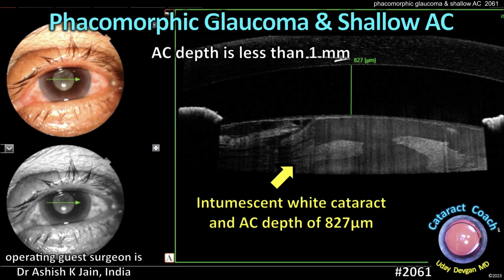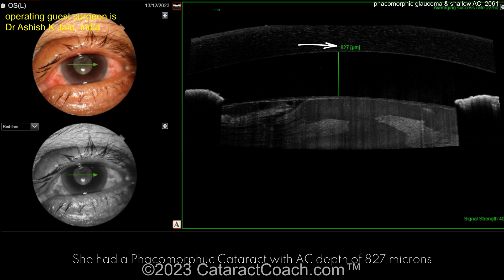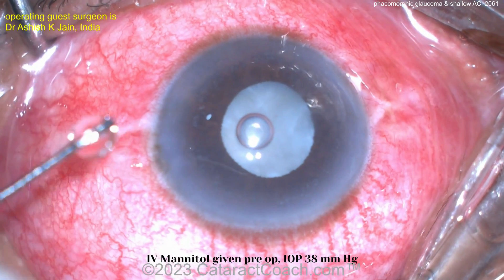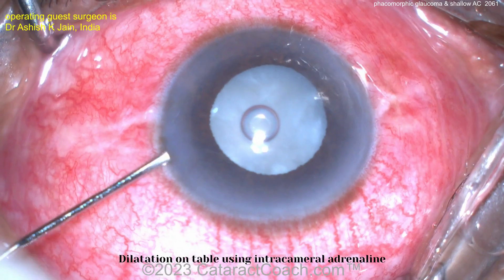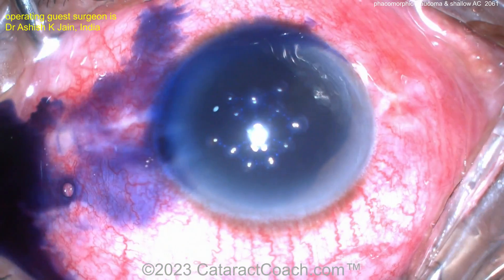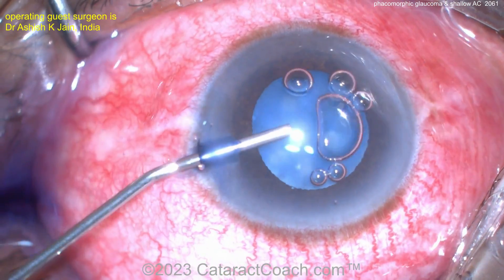Phacomorphic glaucoma and a shallow anterior chamber. The AC depth is less than a millimeter. Tough case — you can see the white cataract. A 50-year-old female presented here with light perception vision for about the last week. You can see on this imaging how shallow the anterior chamber is: 827 microns. The issue is a swollen lens causing angle closure, so we've got to get the lens out and give this patient pseudophakia.